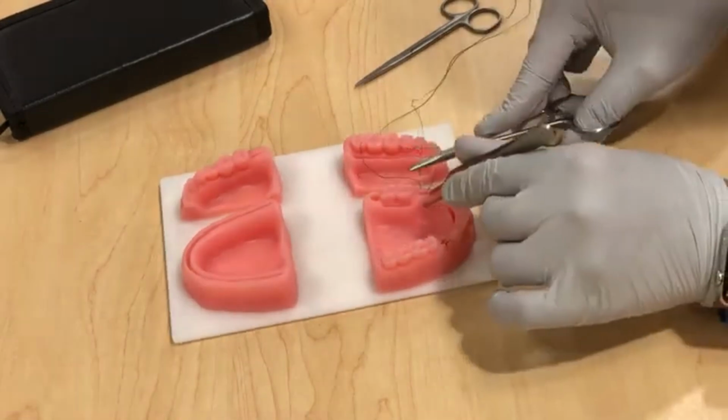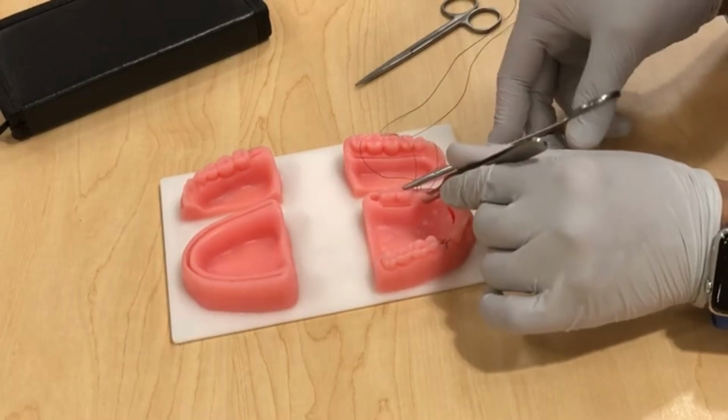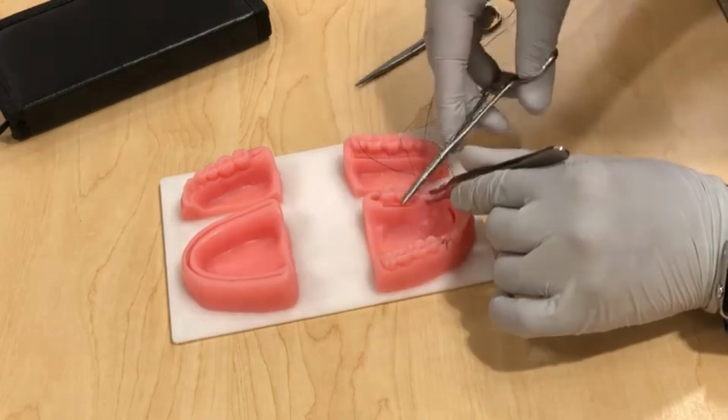We're gonna go and do the same thing. Do another bite through the palatal. Always go around 90 degrees and 1.5 to 2 millimeters from the incision.